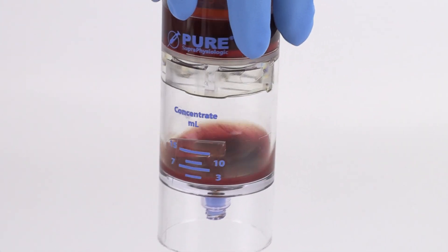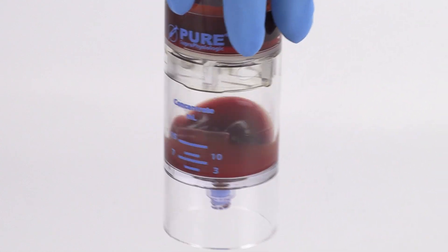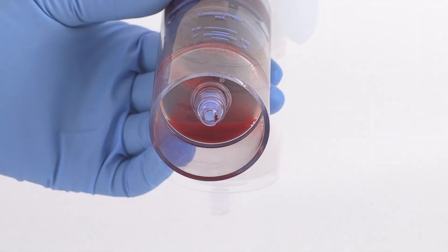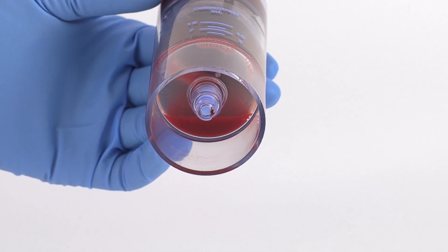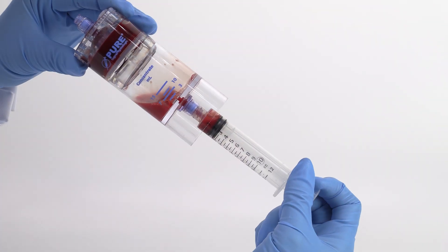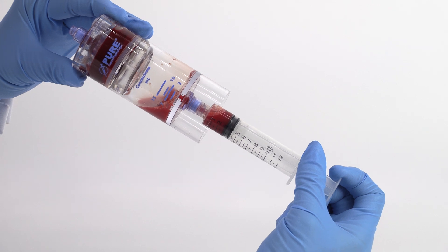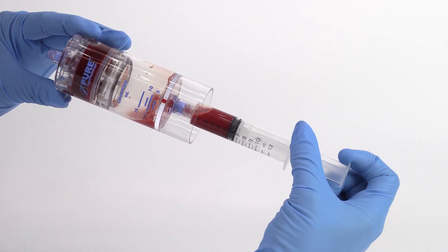Resuspend the cell concentrate back into the plasma by rocking and swirling the device back and forth until all of the concentrate has been resuspended into the plasma and is no longer visible at the bottom of the device. Attach the 12 milliliter syringe to the needleless port and tilt the device to aspirate the bone marrow concentrate.